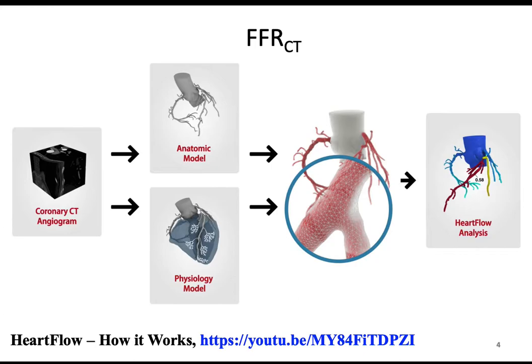Right? You have to have some amount of chest pain. You're not going to just cath everybody in terms of the screening tool. If you see any little abnormality, would you do this procedure? And so a company that came out of Stanford called HeartFlow is trying to come up with that pressure gradient measurement from just the images.